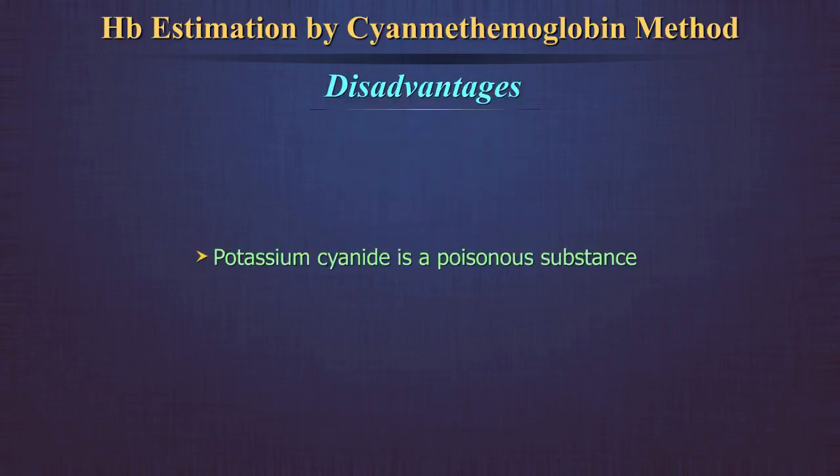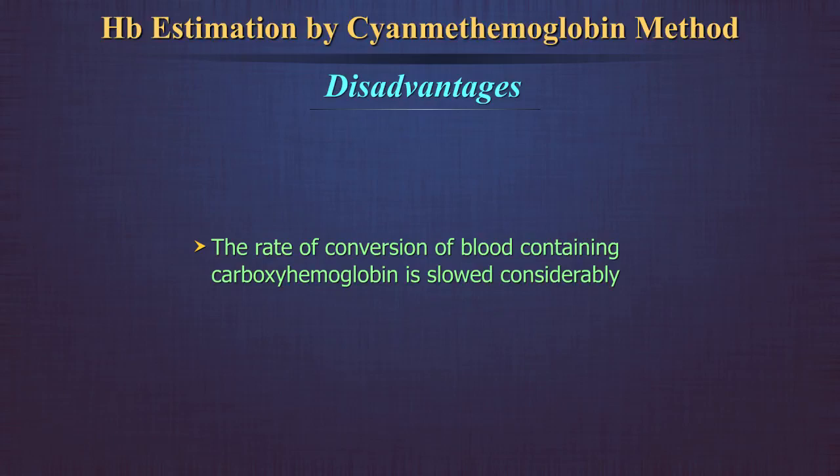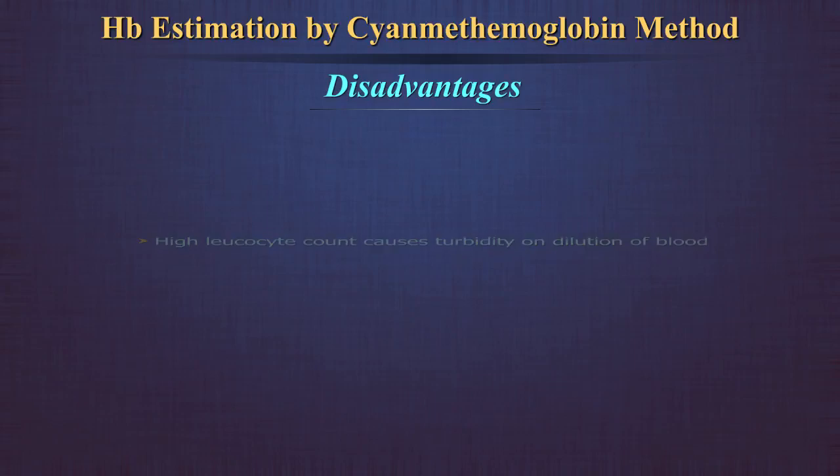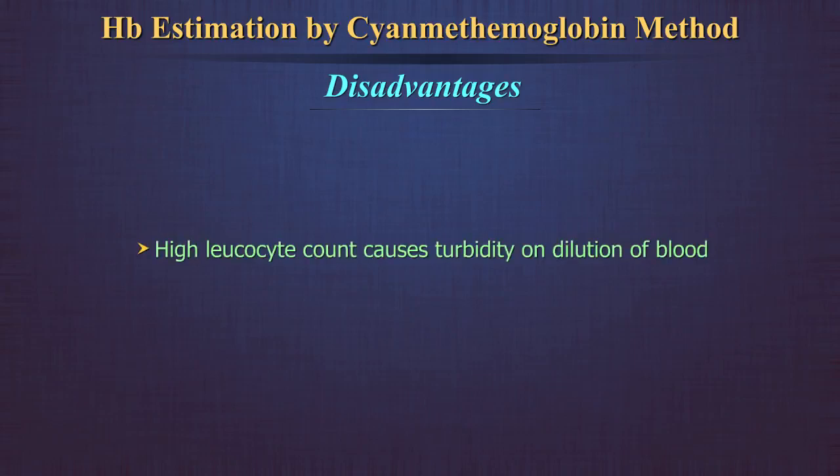Disadvantages: Potassium cyanide is a poisonous substance, and that is why Drabkin's solution must never be pipetted by mouth. The rate of conversion of blood containing carboxyhemoglobin is slowed considerably; prolonging the reaction time to 30 minutes can overcome this problem. Abnormal plasma proteins cause turbidity when blood is diluted with Drabkin's solution, and a high leukocyte count also causes turbidity on dilution of blood. Centrifuging the diluted blood can help overcome the turbidity.